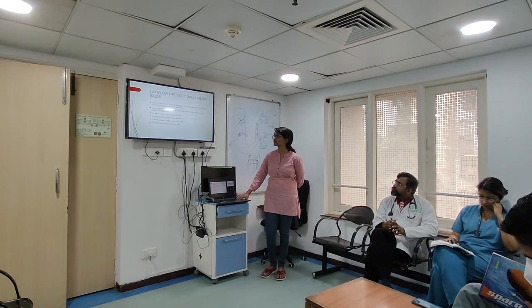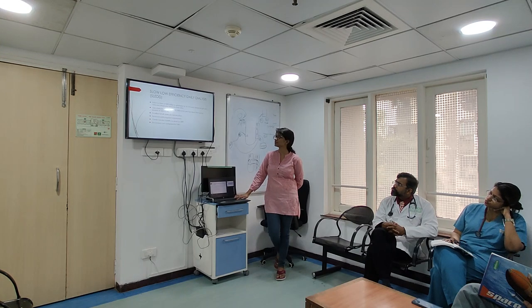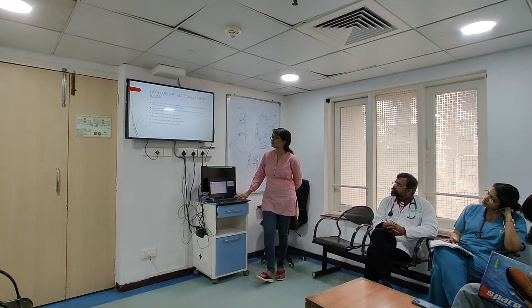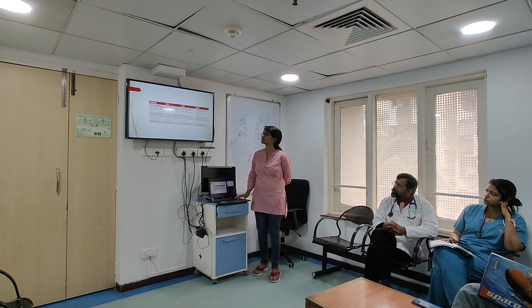Next is SLED. It is slow, low efficiency daily dialysis. It is an extended form of intermittent hemodialysis. It usually takes a 6 to 10 hour session length. The dialysate flow rate is usually 100 to 300 ml per minute with a low blood flow pump speed of 200 ml per minute. This is basically a hybrid technique of both. It uses both IHD and CRRT. It causes excellent small molecule detoxification. The requirement of anticoagulant is reduced. Cardiovascular stability is as good as CRRT, and the cost is decreased as compared to CRRT.